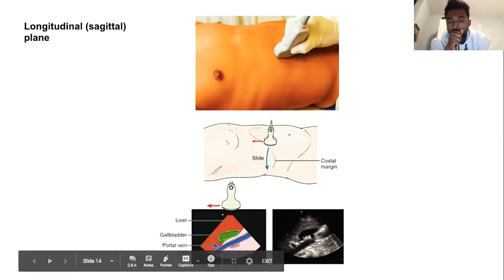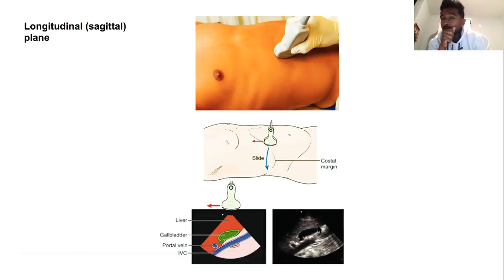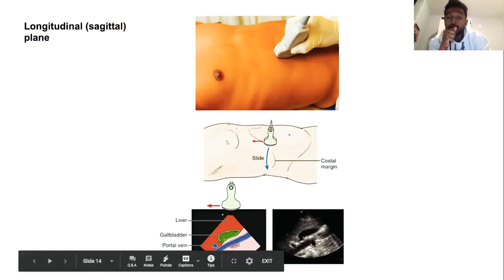So you're gonna see the fundus, obviously the most inferior anterior part, and then deeper to it and a little bit medial to it. I think he's angling the transducer a little bit towards the lateral side, because otherwise you wouldn't see the fissure.